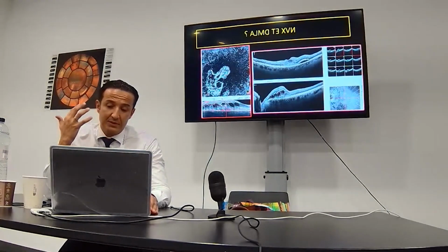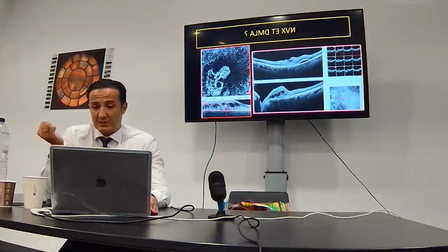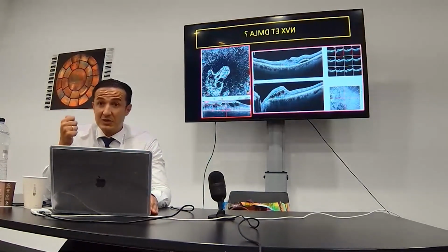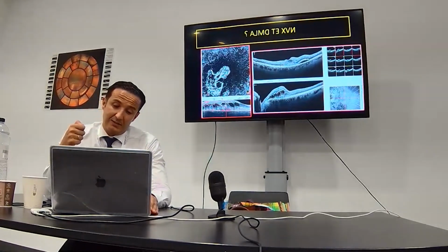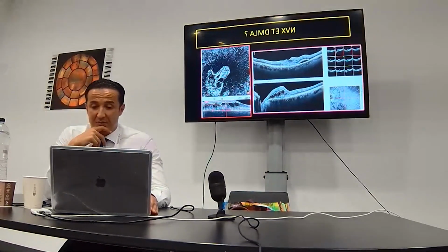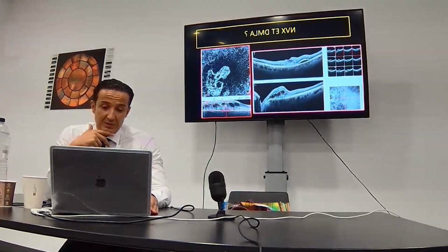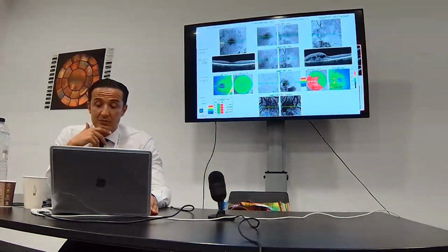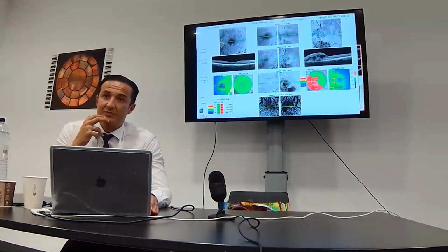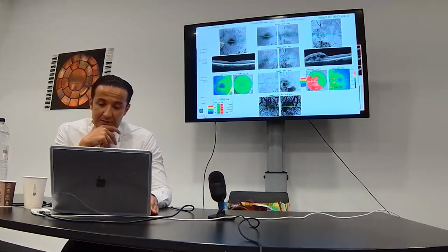And sometimes you can have pachychoroid associated with the CNV, and it's a game changer to make a good diagnosis, to give a good treatment, like a combination therapy of anti-VEGF plus PDT. And look here, you can see a beautiful signal of the decorrelation. But here, in the retinal cube, we observe a dilation of the choroid corresponding to the pachychoroid spectrum, and the diagnosis was CNV in pachychoroid spectrum.